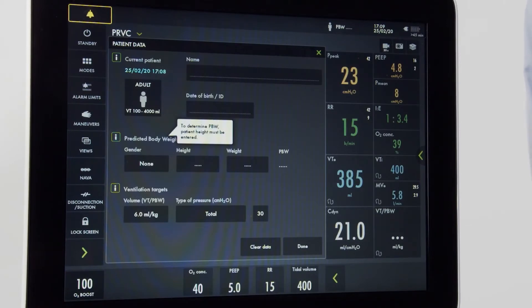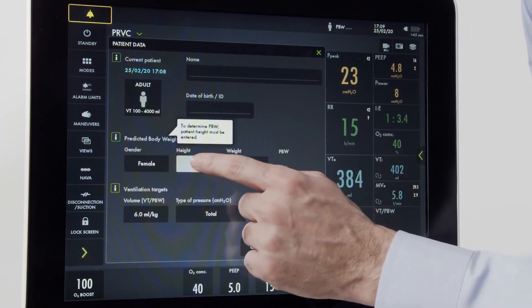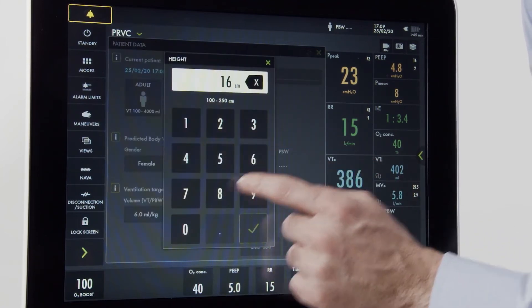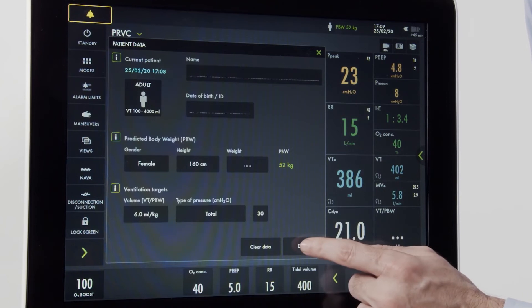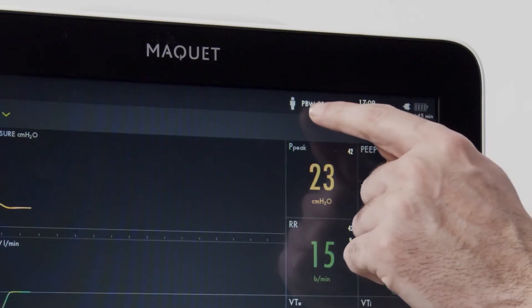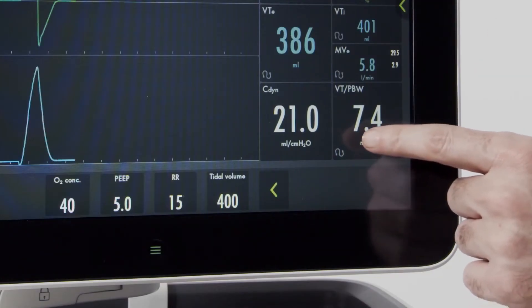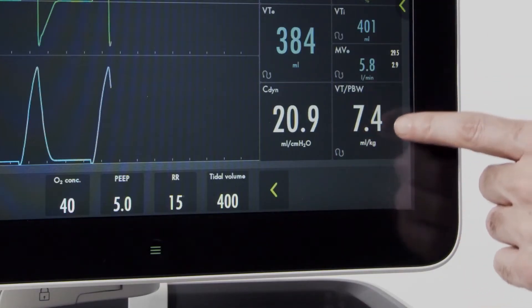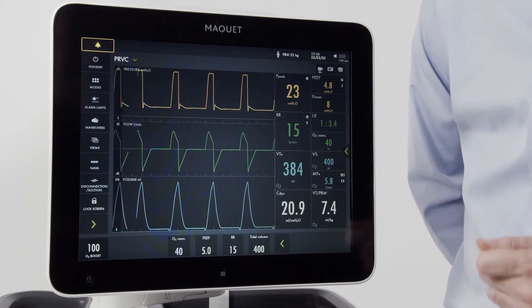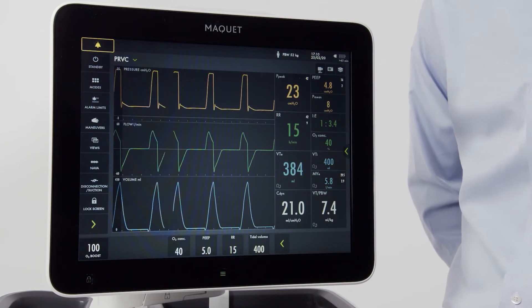I need to input the gender and the height of my patient. I can also push information to get more data. Let's input a female that's a height of 160 centimeters. Once I've pressed done, I now have the predicted body weight displayed on the screen and the tidal volume for each breath is now displayed. If I want to adjust the tidal volume according to body weight, I now have the ability to do that on the screen.